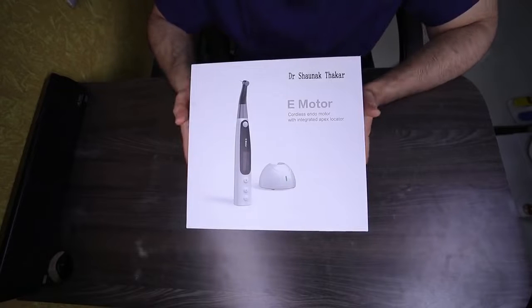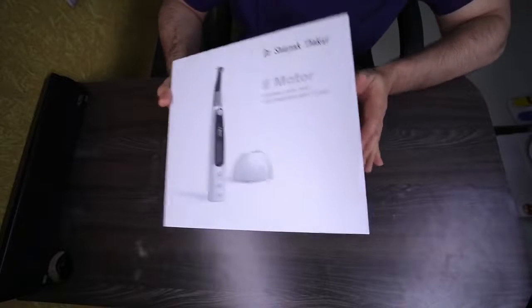So my friends, without much ado, let's unbox the Endomatic e-motor. So here we have the Endomatic e-motor from Woodpecker. We'll unbox it right now.